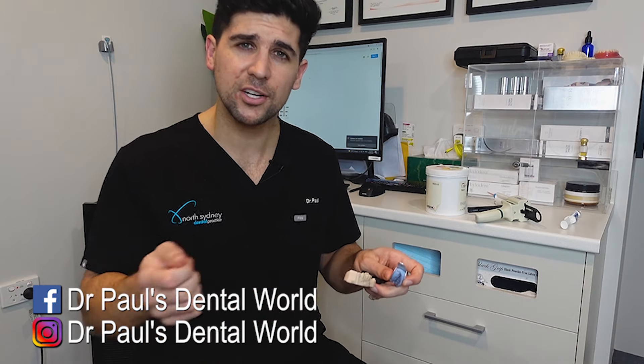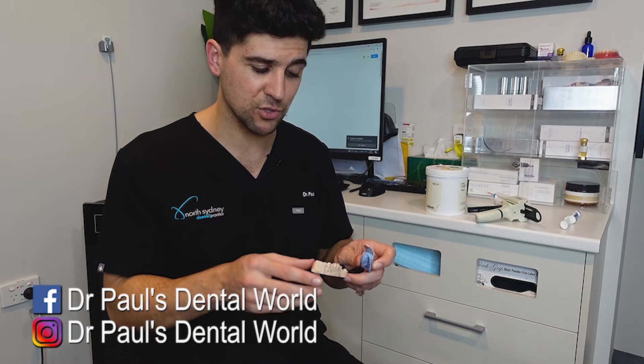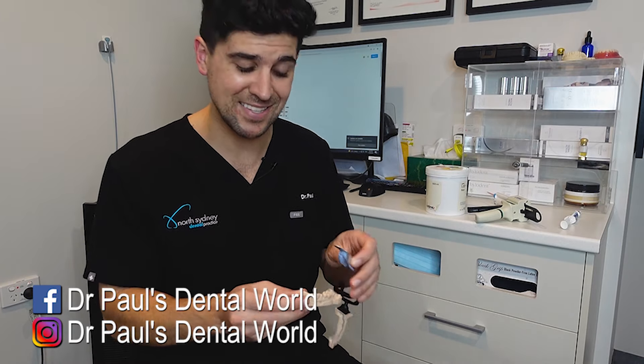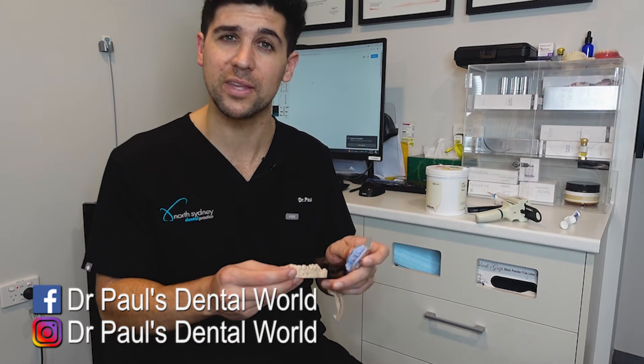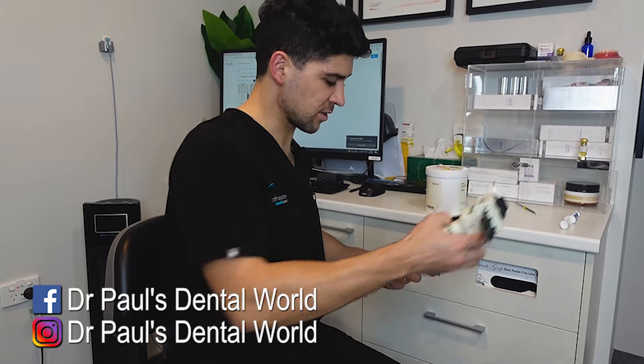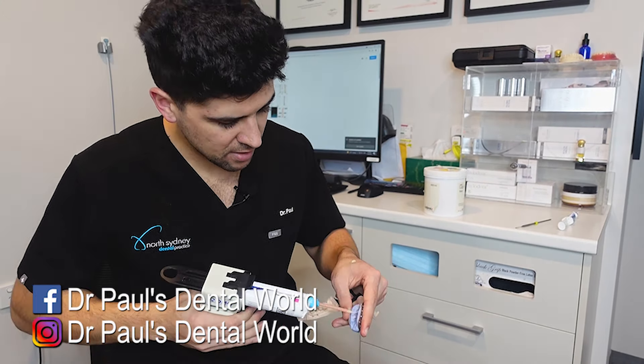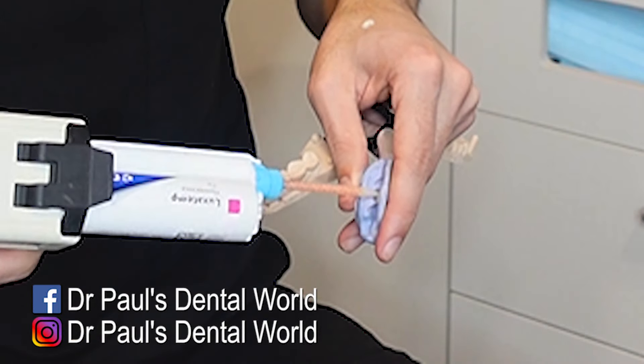Now, in the mouth, I don't actually dry the tooth first. Basically, the patient would have closed their mouth and they've got saliva on the tooth. That saliva will help to make sure that my temporary crown doesn't stick to the tooth when I come to remove the index. In this case, I put Vaseline on here to do the same sort of thing. So the first thing is that I'm going to bleed some out and I'll put that on the back of my glove, and then put some in the tooth that I'm working on.